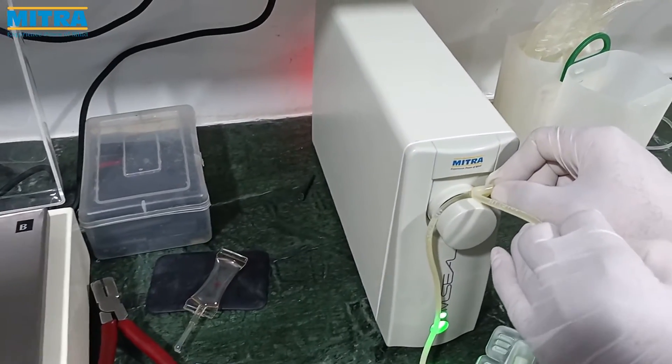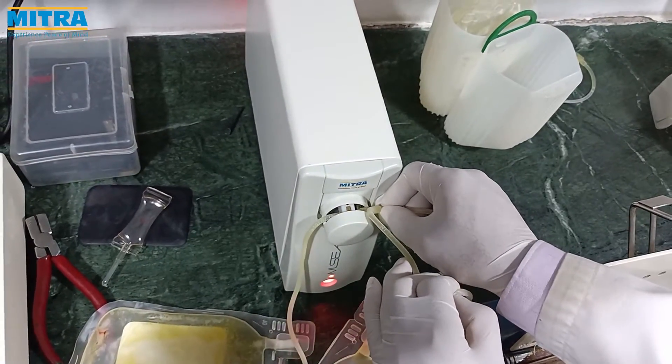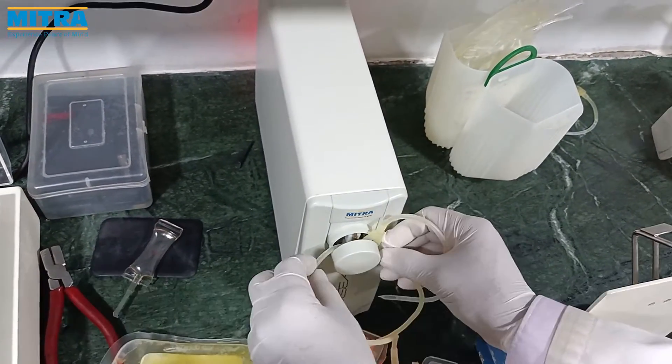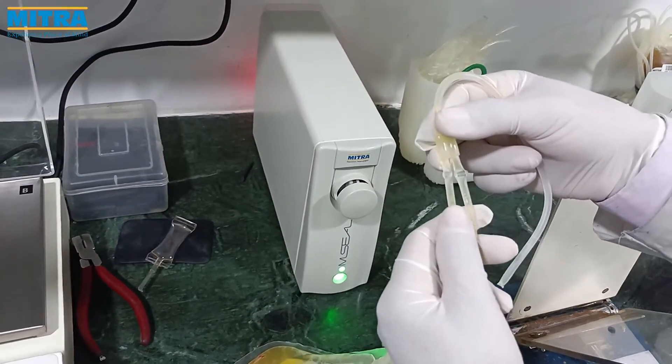Seal the tube when the indicator is green. During the sealing process the indicator glows red. Wait for the indicator to turn green from red to start another sealing process.